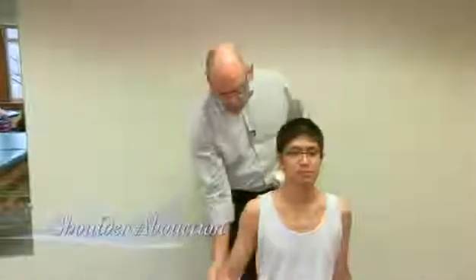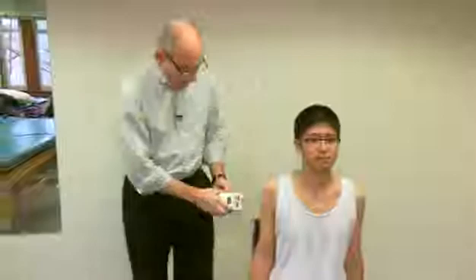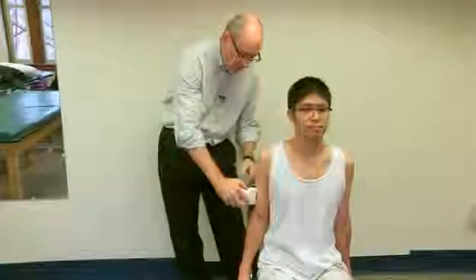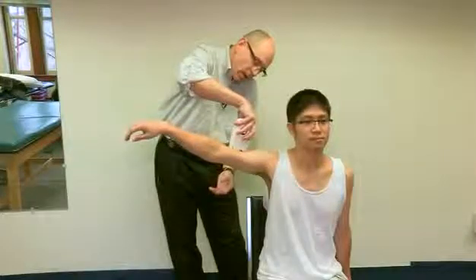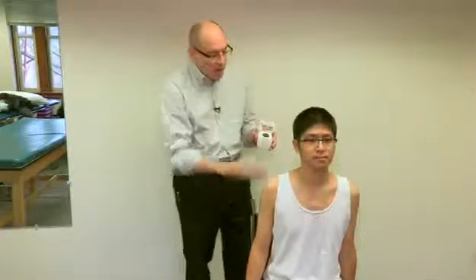Another upper limb motion we can measure is shoulder abduction, where the arm comes out in the frontal plane. I set the inclinometer on his arm. Now raise it up as far as you can. I set it again, and we end up with 104 degrees of abduction. That makes sense — his arm came up beyond horizontal while his trunk stayed vertical. We could also have done shoulder flexion, but the point is made with the abduction measurement.